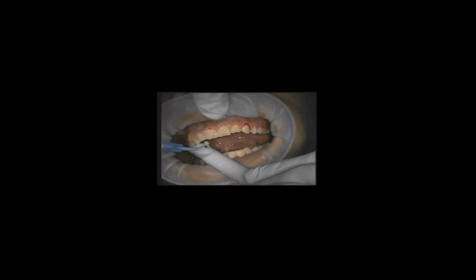And we're just using a little bit of hydrogen peroxide to do some cleanup. Peroxide will actually, if you've got a little bit of bleeding in the tissue, also help as a coagulant.